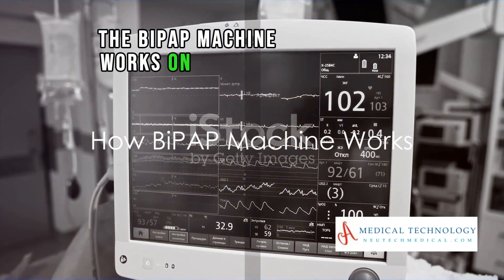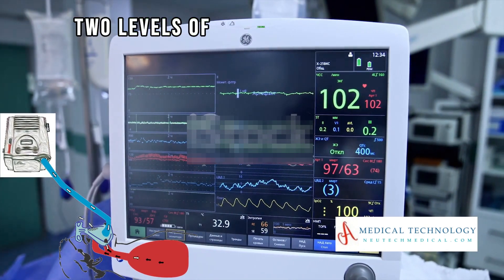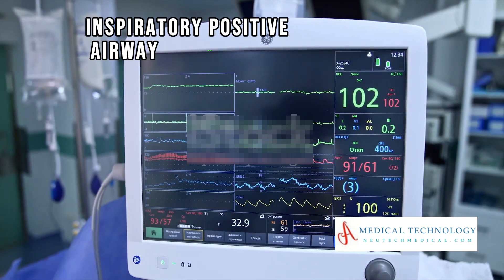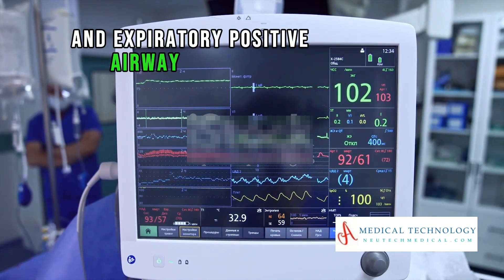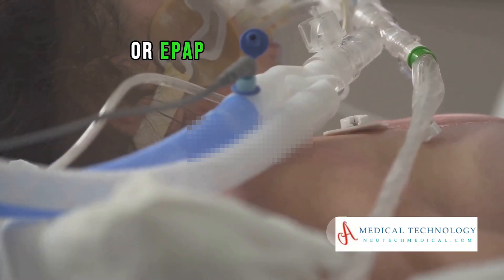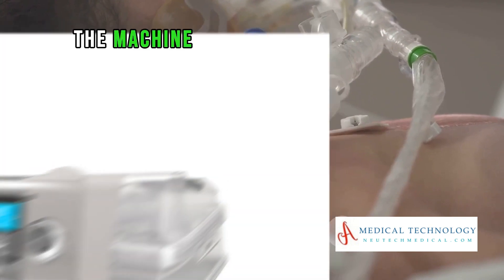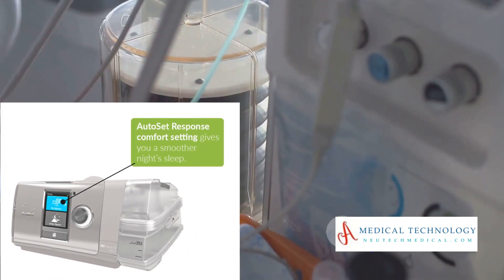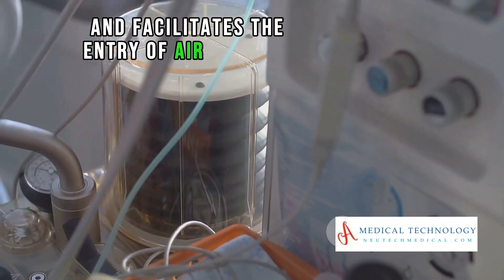The BiPAP machine works on a simple yet effective principle: it delivers two levels of pressure during the breathing cycle — Inspiratory Positive Airway Pressure, or IPAP, and Expiratory Positive Airway Pressure, or EPAP. During inhalation, the machine delivers a higher pressure, known as IPAP. This pressure helps to open the airways and facilitates the entry of air into the lungs.